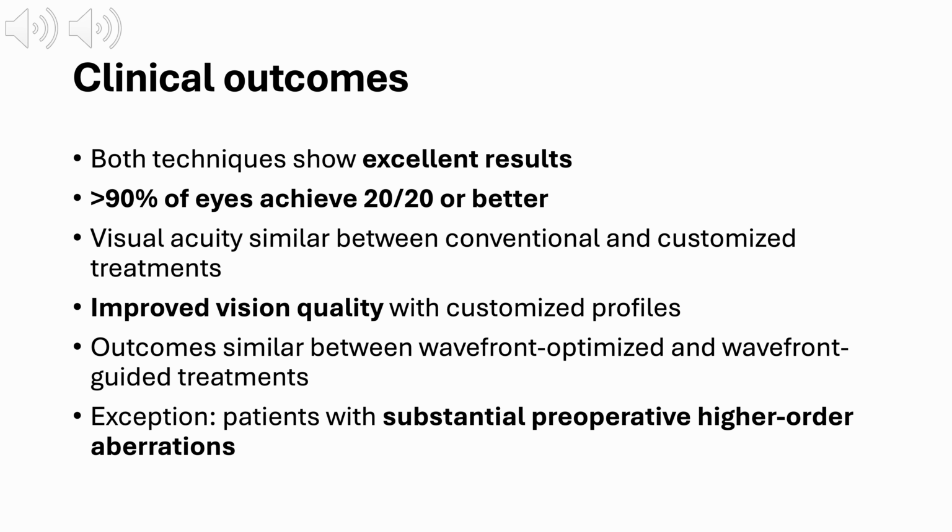The big picture is that all modern excimer laser techniques perform extremely well. Across multiple studies, more than 90% of treated eyes achieve 20/20 vision or better, regardless of whether a conventional or customized profile is used. When we look strictly at visual acuity, outcomes are remarkably similar between conventional treatments and customized treatments.